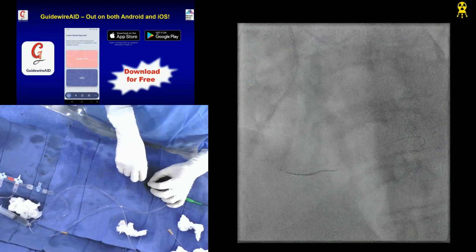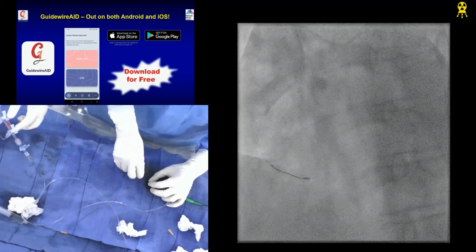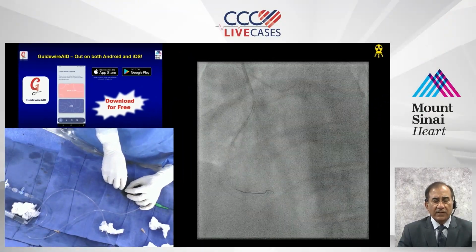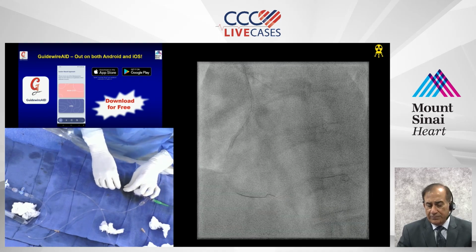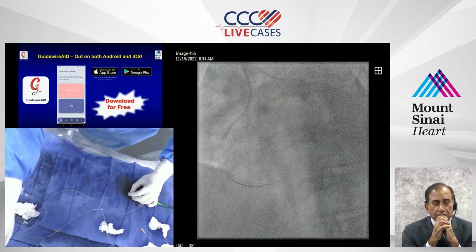A 37-year-old with multiple stents, still areas of the vessels which have lingering disease, he needs very aggressive lifestyle modification. And you want to give me a 2.0 balloon? Maybe just with the balloon I can, right? Yeah. Yep. 2.0 or 1.2 balloon? Yeah. We have it. Track?